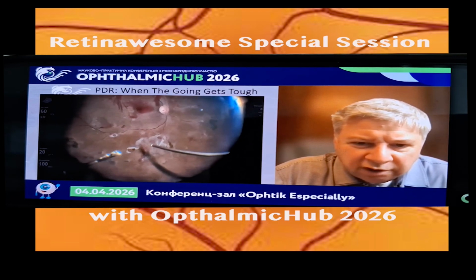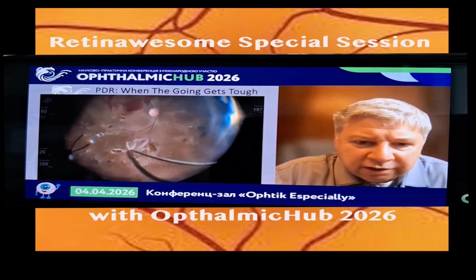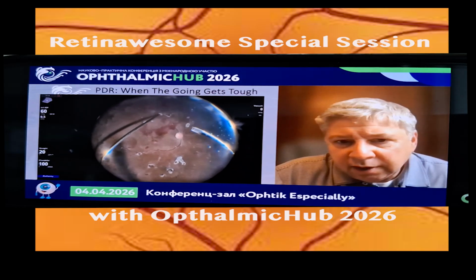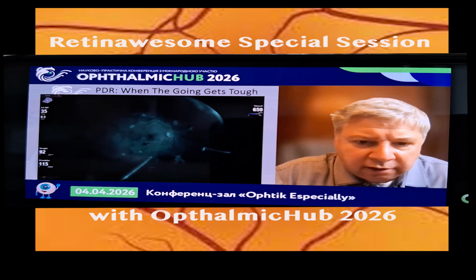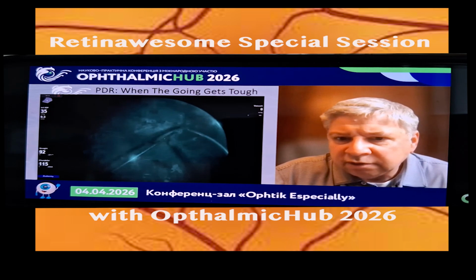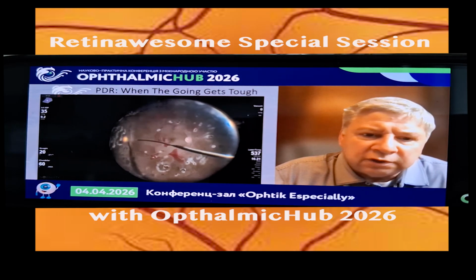So this is one where, how much do you peel? I kind of felt like I could get most of this off relatively atraumatically. We then are doing fluorescein angiography just to look at, is there any occult neovascularization or hot spots? And here we found some fluorescein leakage.